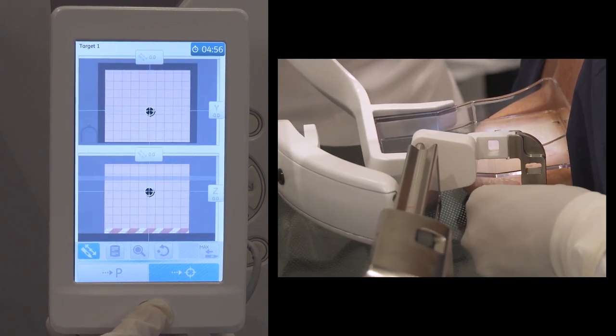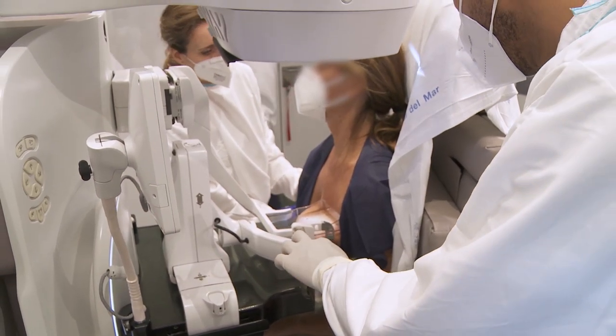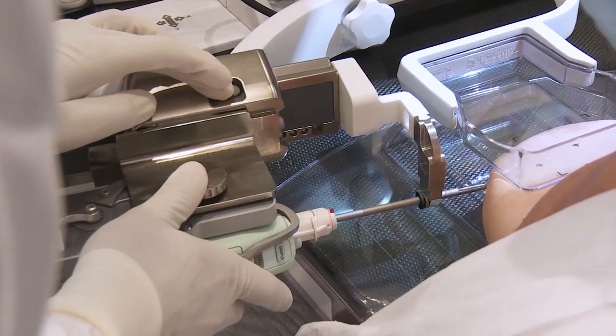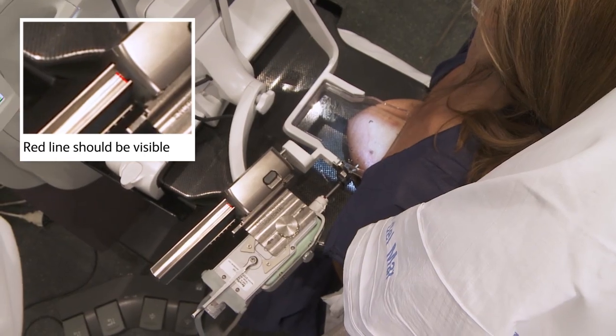Introduce the needle guide. Attach the horizontal approach adapter with the EnCor device to the biopsy head slider. The slider is driven manually all the way. The red line on the biopsy holder should be visible.